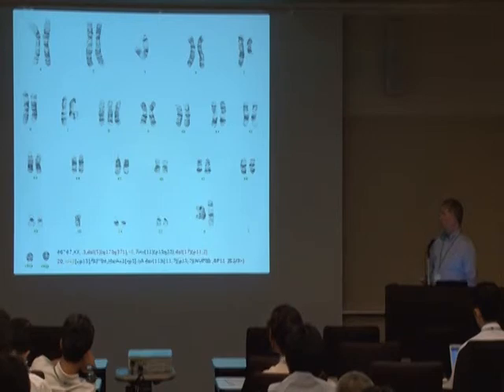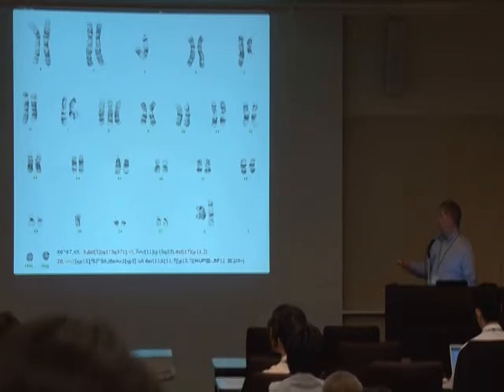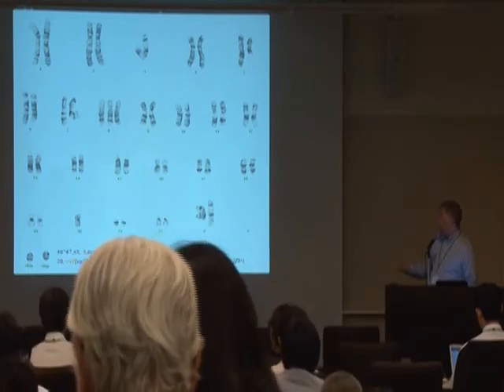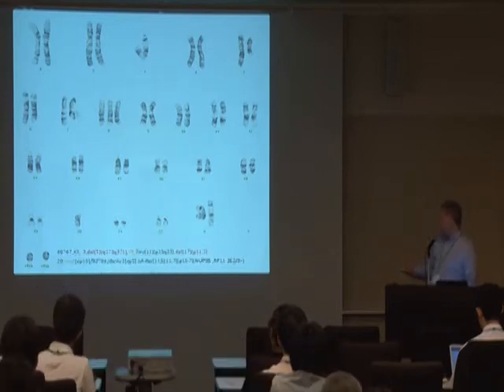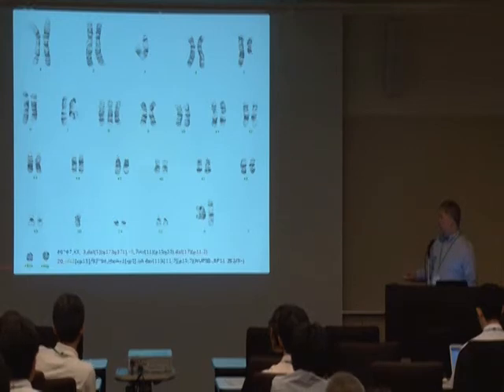And if you're familiar at all with myelodysplastic syndromes or acute myeloid leukemia, you'll probably recognize a lot of the chromosome abnormalities here. And these are fairly complex cases in terms of metaphase cytogenetics, and you can see here loss of a chromosome 3, deletion of chromosome 5q. We have trisomy for chromosome 8. We have a small abnormality on the P arm of chromosome 11. It was very difficult to tell what it was because it was relatively small. A deletion of chromosome 17p. We're also missing a chromosome 20 here. And we had these two little ring chromosomes that were interesting. We weren't really sure what they were.